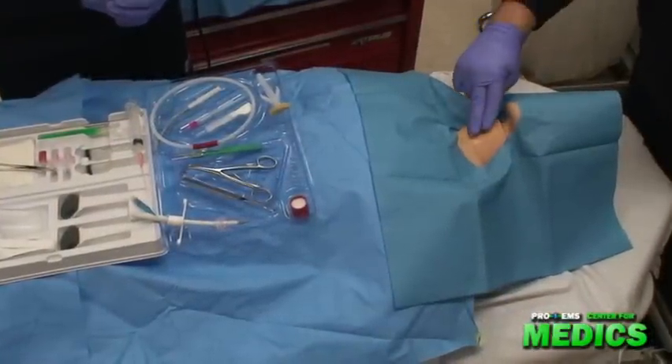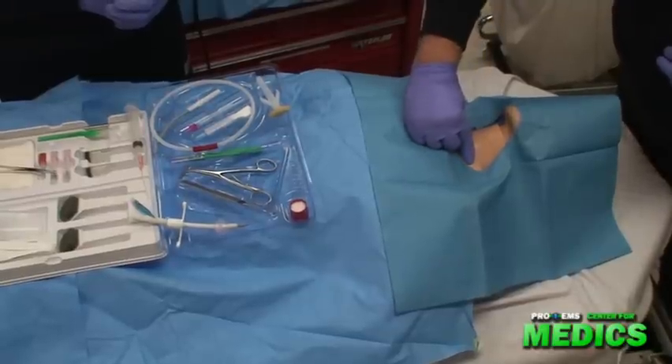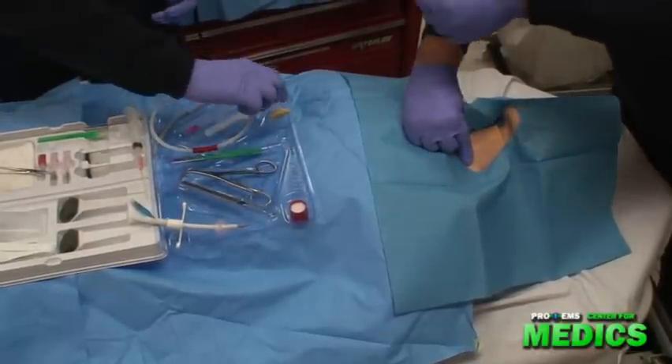I'm going to begin by locating the cricothyroid membrane. And I'm going to cleanse the site using aseptic technique.